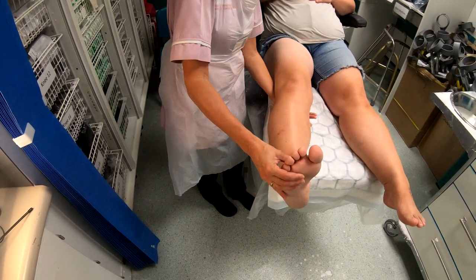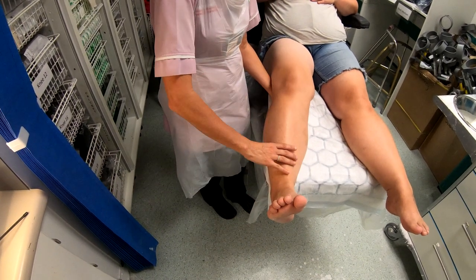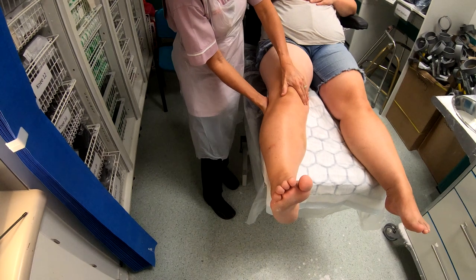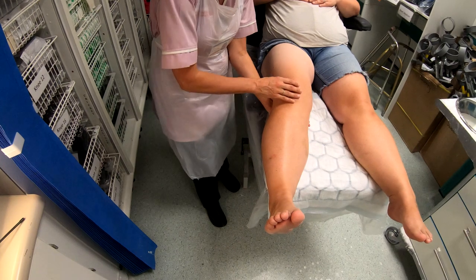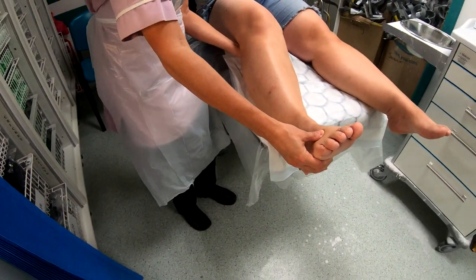You also need a 10-degree flexion of the knee. We don't want full extension, otherwise it locks the knee out and it can cause cramp and be very uncomfortable. So that's all very difficult to concentrate on when you're doing it in one full piece.